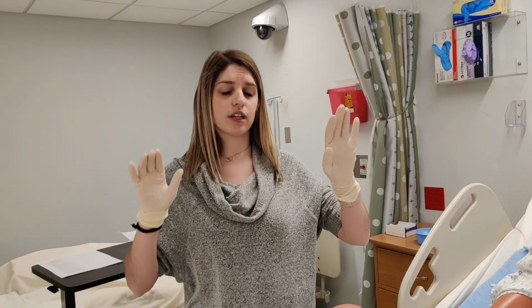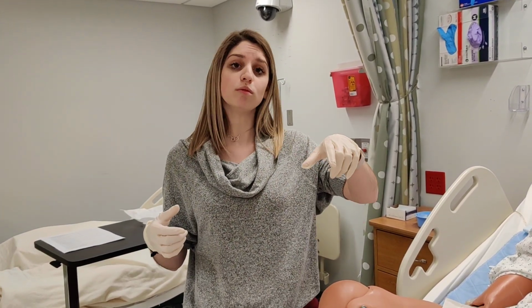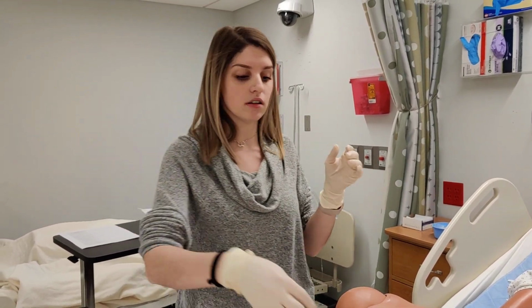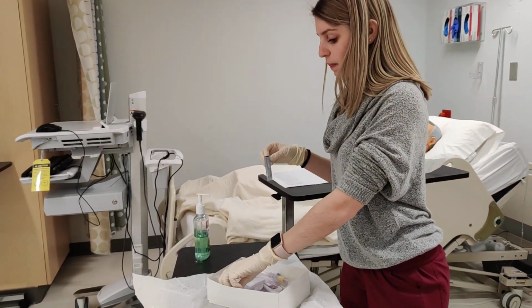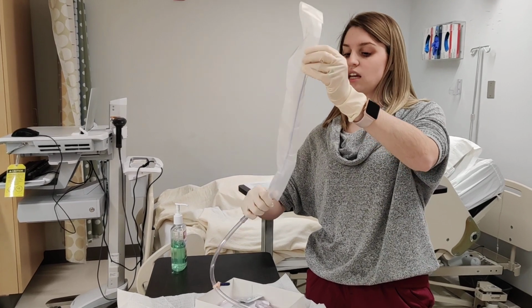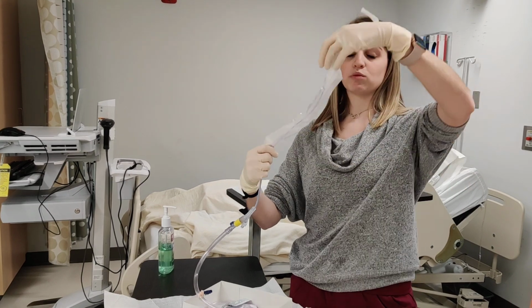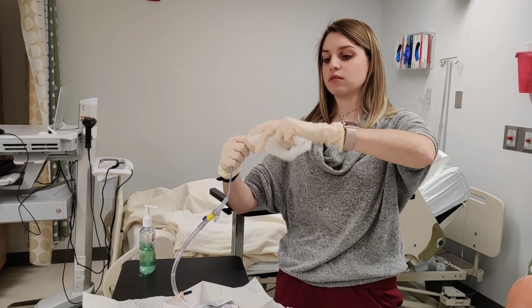Before I decide dirty versus clean hand, guys, I'm going to take both sterile hands and put my catheter, the inserted part of the catheter, into the lube, just so that it's ready to go when my patient is cleaned. So I'm going to take my lube, and when you take the catheter out of the box, it's going to have this sheath on it. Take this off and coil the catheter in your hand, and be sure that you don't just rip this off, because if you do, it's going to flop all over the place and you're going to break sterility.